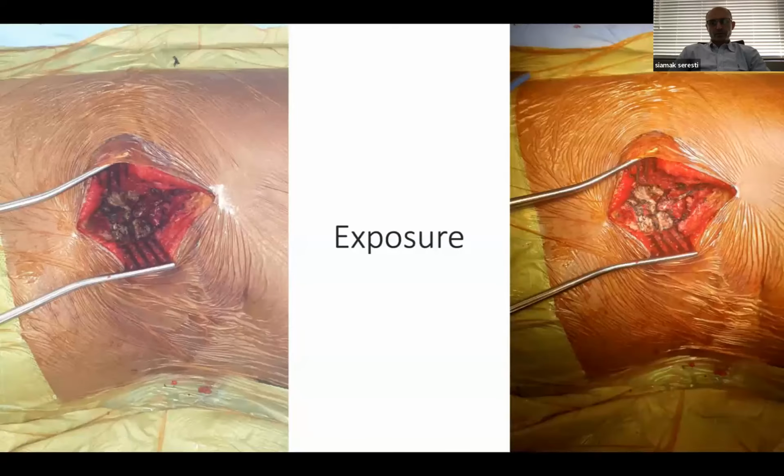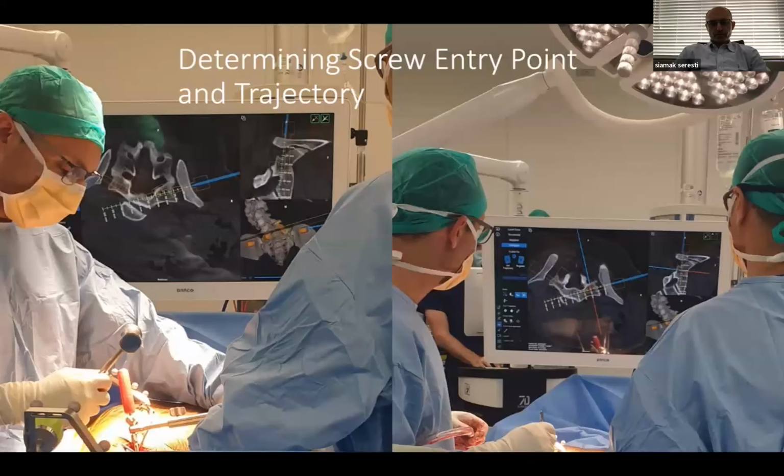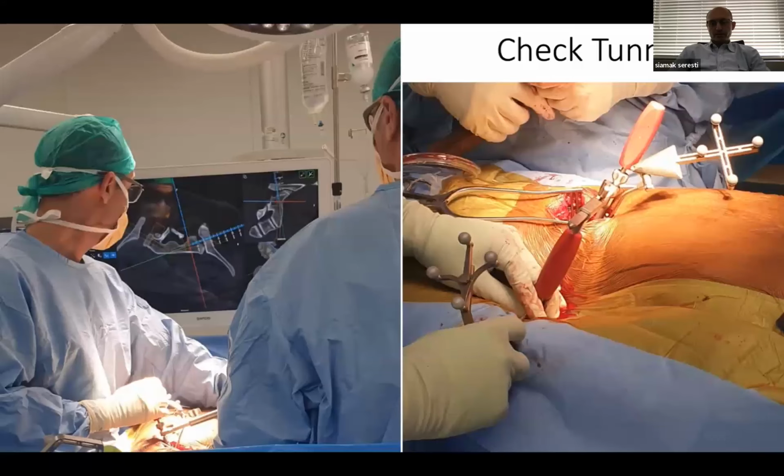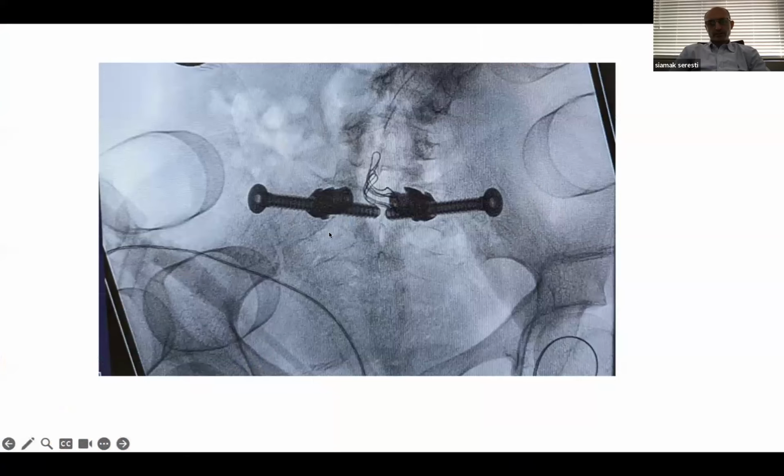That's the exposure usually enough to put the iliosacral screw, but also more importantly, the distal part of the device, which is the NEMOS rod that I'll show you later. I'll quickly go through the navigation, which obviously anyone used either Brain Lab or 7D is registering with 3 points. Connector, we try to navigate an instrument first, and then the iliosacral screw. This is just a checkpoint to make sure the screw is going through the pelvis. And also I'll do the X-ray at the end. That's pretty much a picture I would like to get.